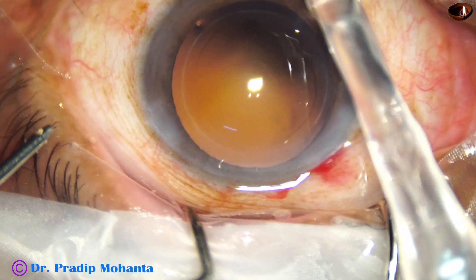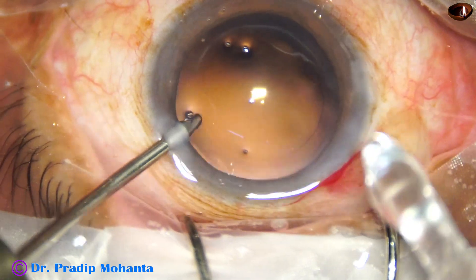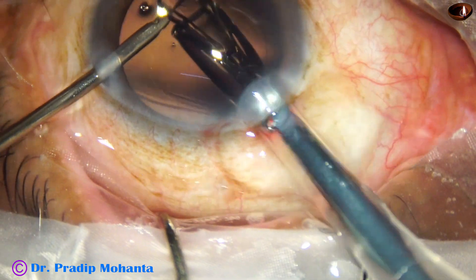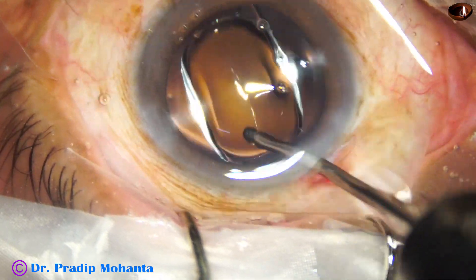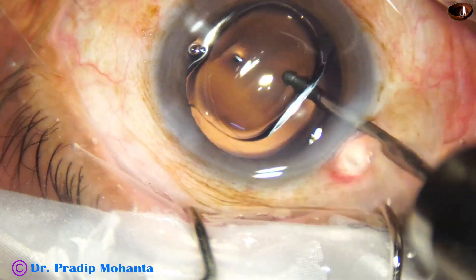Now here goes a single piece monofocal hydrophilic intraocular lens. The lens is placed in the capsular bag.